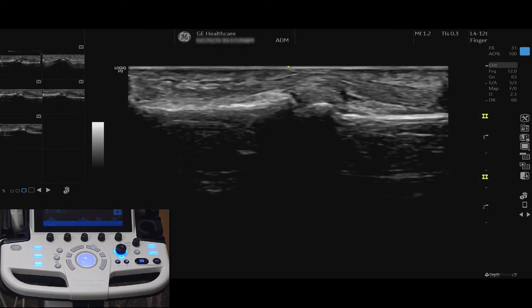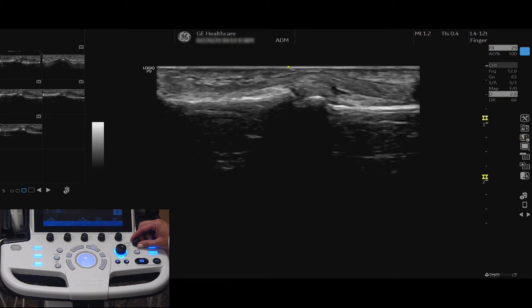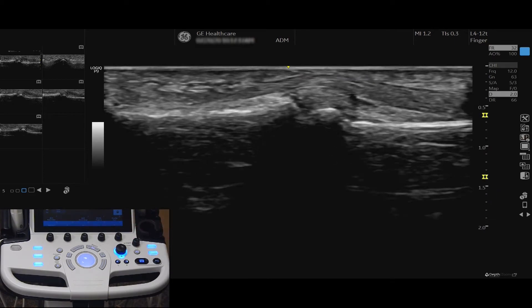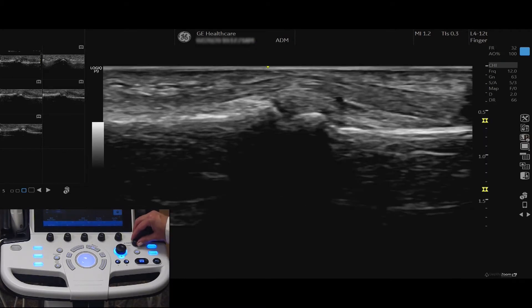To adjust your depth, turn the depth button. You will see the centimeter markers displayed on the right-hand side of your monitor. Push and turn the depth button to zoom or magnify your image.